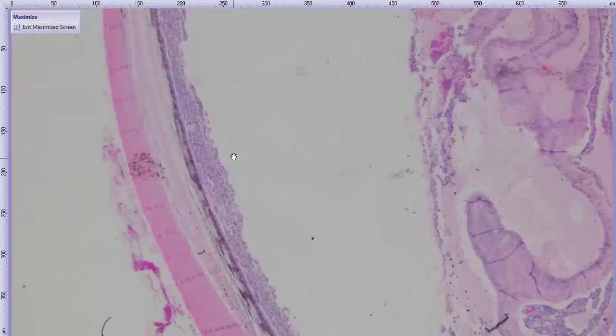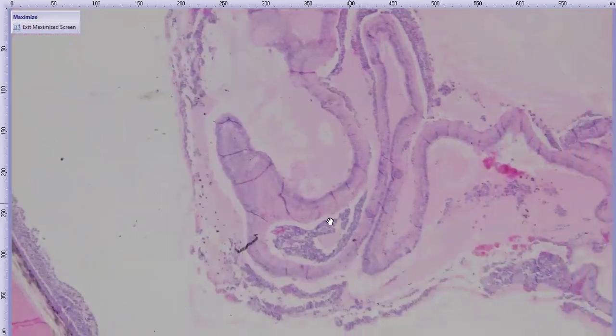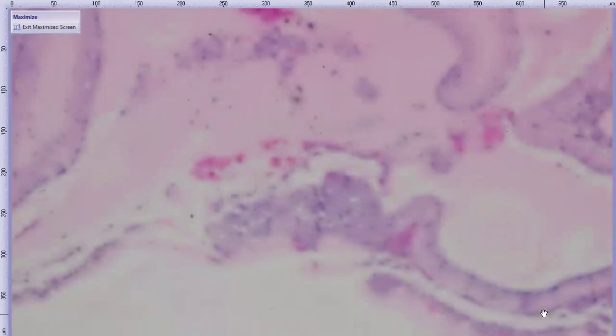And then back here, we have cells essentially carpeting the epichoroidal surface and basically carpeting the retinal surfaces, as well as multifocally invading the retina itself. So when I look at this posterior segment from really low magnification like this, it actually puts me in mind of fungal disease, because oftentimes that'll present mostly in the posterior segment, often kind of subretinal and carpeting epichoroidal surfaces. So I was all like, it looks like we might have some infectious disease here. However, you zoom in on these guys.